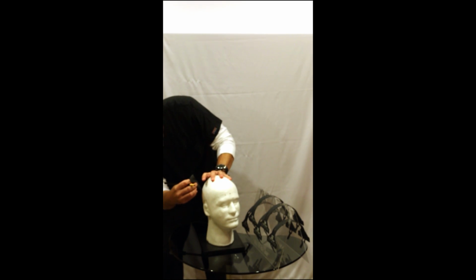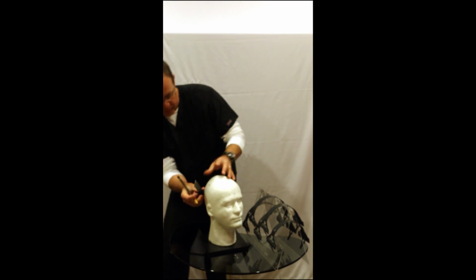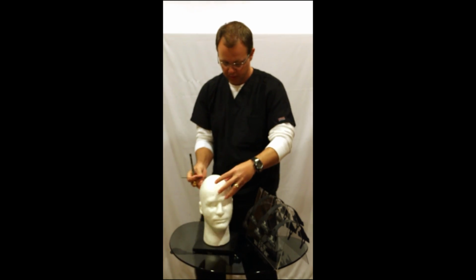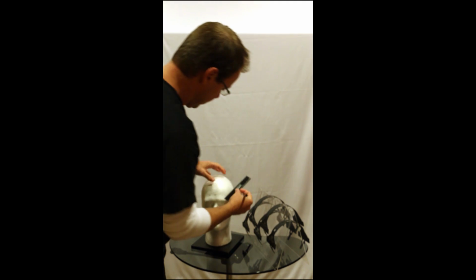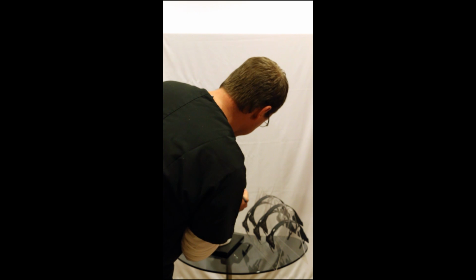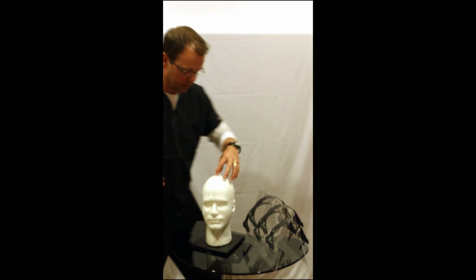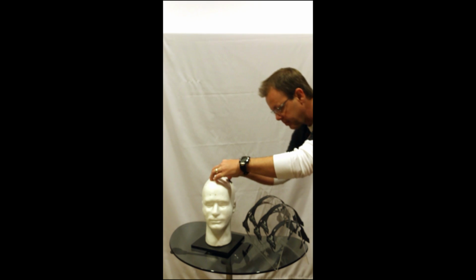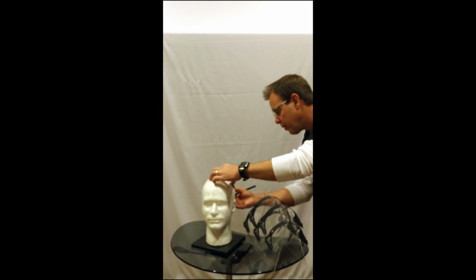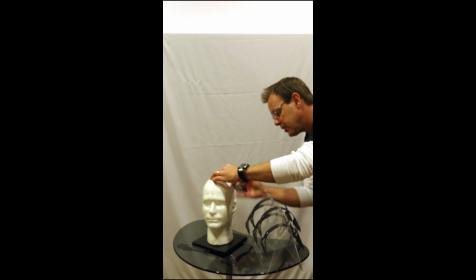It's roughly the same distance, 11 centimeters, so I'll do 5.5. 11 centimeters is roughly 5.5. 11 centimeters, 5.5.